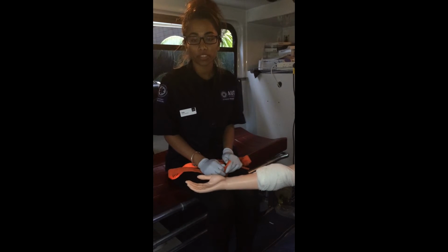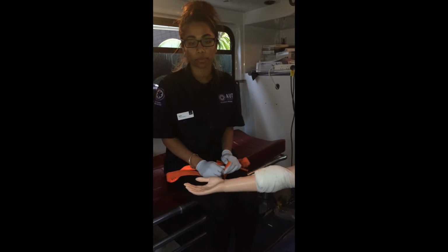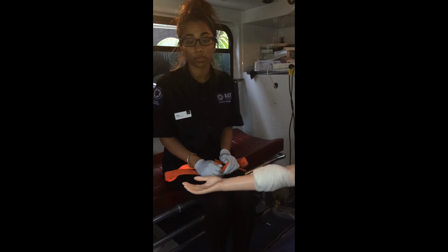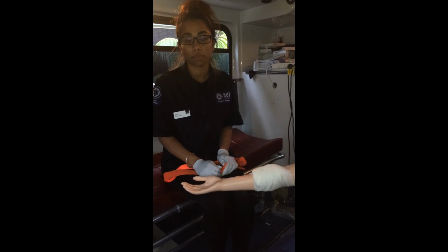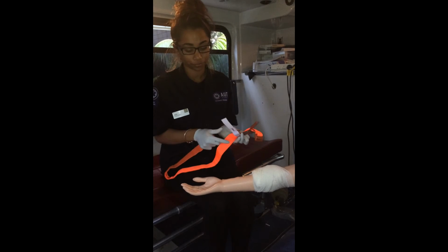For catastrophic hemorrhages, you want to apply a tourniquet, so this needs to be done at least 10 centimeters proximal to the wound. Once this is done, you want to tighten the windlass until bleeding has arrested or the distal pulse disappears. And if bleeding is still profuse, apply a second tourniquet, and always remember to record the time of application on the white tabs located on the tourniquets themselves.